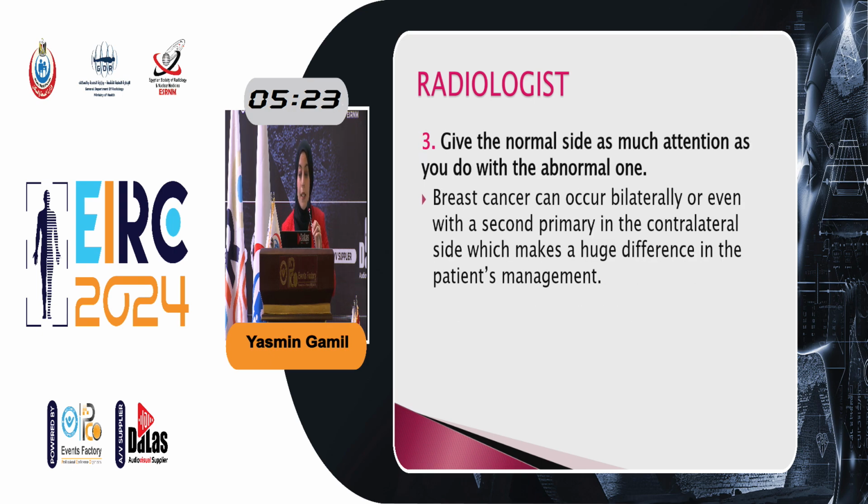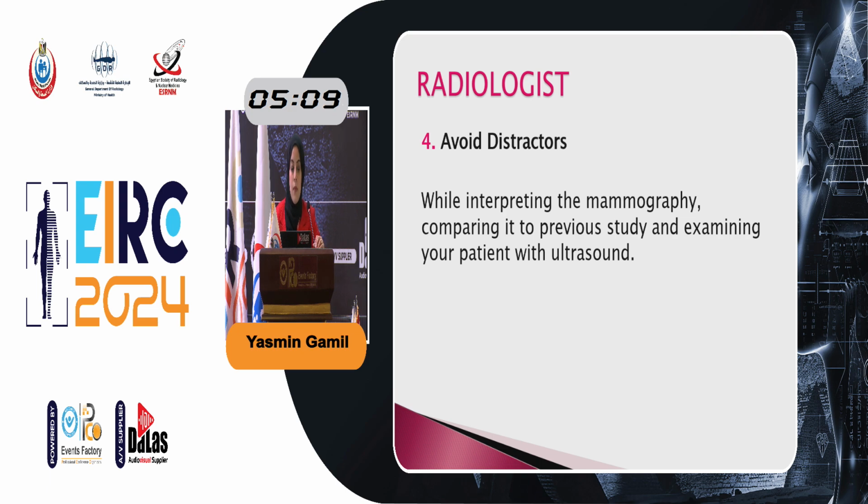You should give the normal side as much attention as you do with the abnormal one, because breast cancer can occur bilaterally or even with a second primary in the contralateral side, which makes a huge difference in the patient's management.